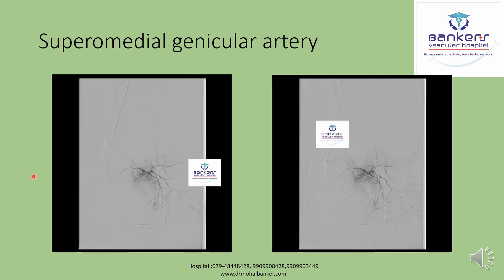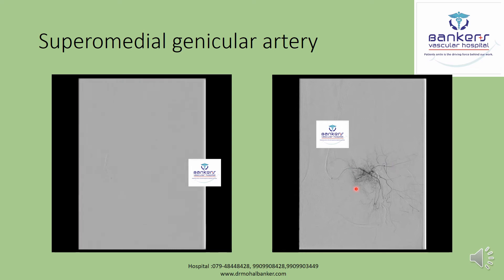Now let us look at the third genicular artery, called the supramedial genicular artery. With a microcatheter cannulated inside this supramedial genicular artery and contrast injected, you can see a blackish area here — that is called vascular blush or neovascularization. This hypervascularity is suggestive of inflammatory action and cytokine release at this site, classically seen on selective angiography. The pain marker is situated right here, and these inflammatory sites are also near the pain marker, confirming that the supramedial genicular artery is the culprit for cytokine release.